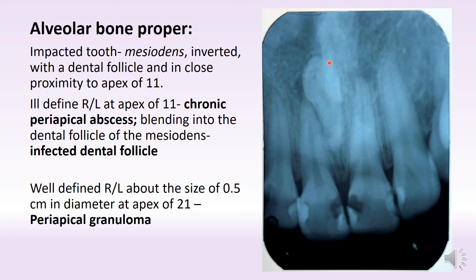Now moving on to 2-1, what we see is a reasonably well-defined radiolucency at the apex of 2-1, which is about 0.5 cm in diameter. I haven't outlined it because I want you to visualize it yourself.